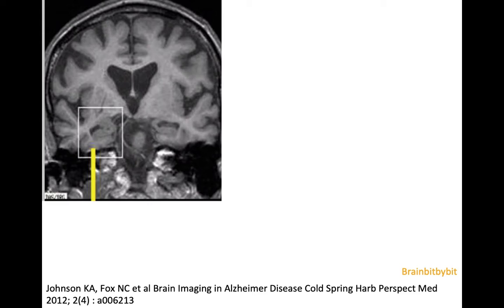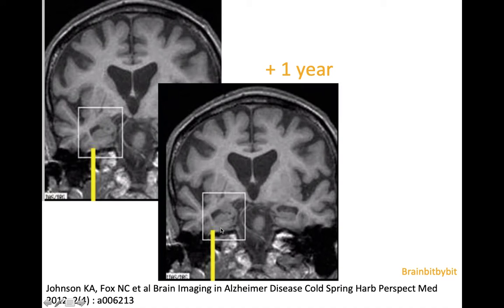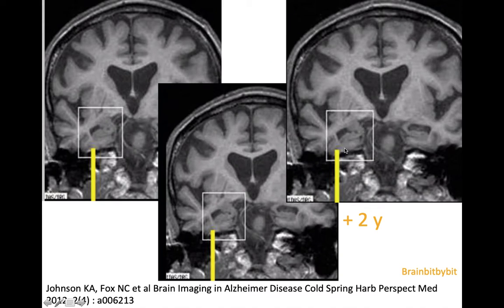It might be very difficult, because you have to correlate to what is normal for the age of the patient, and if available, you can compare to older images. These are T1-weighted images of patients with clinical symptoms of Alzheimer's disease, who had progressive volume loss and worsening of symptoms after one year, and at MRI follow-up after two years, with progressive volume loss of the entorhinal cortex and hippocampus.